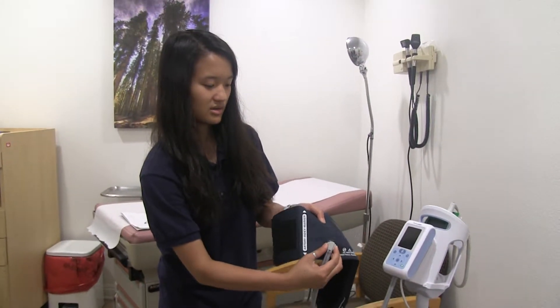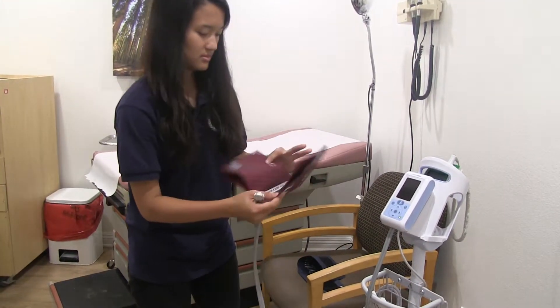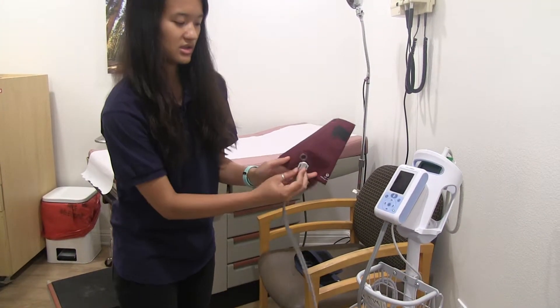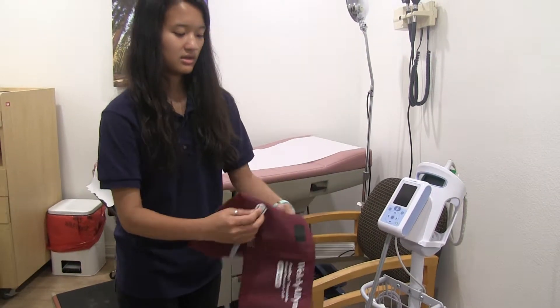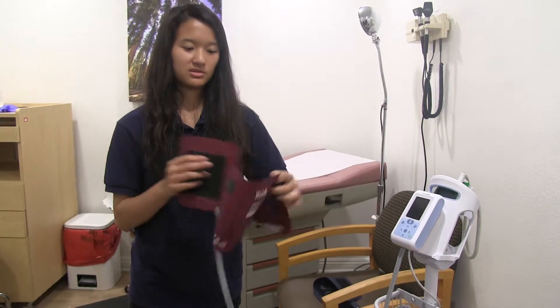You're just going to press here and pull it out, then click it in here, and then you just perform your blood pressure measurement the same as normal.